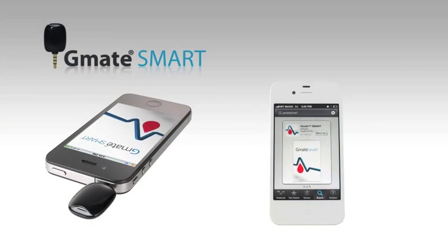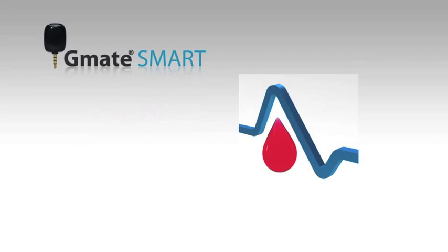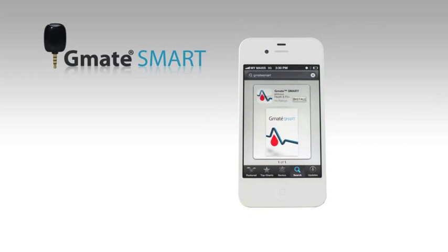The G-Mate Smart connects directly to the headphone jack on the iPhone. It is the only device to utilize the headphone jack as a power source and data connection point. With a simple download of a free G-Mate Smart app from the iTunes App Store, the G-Mate Smart interfaces directly with the iPhone operating system.